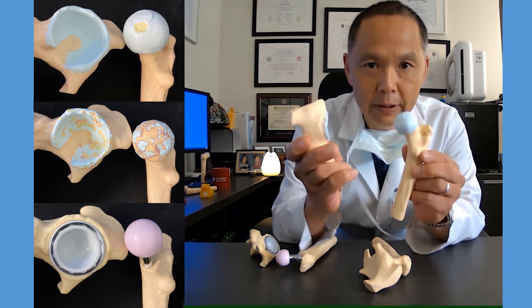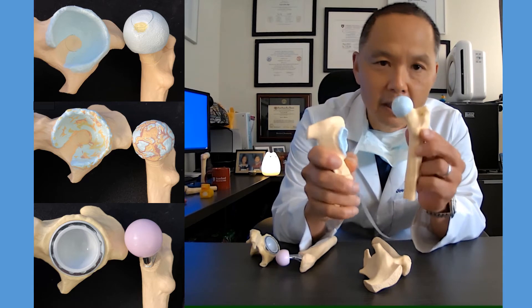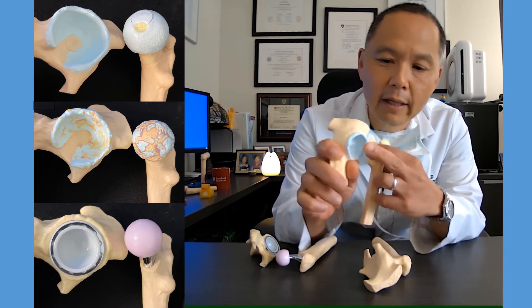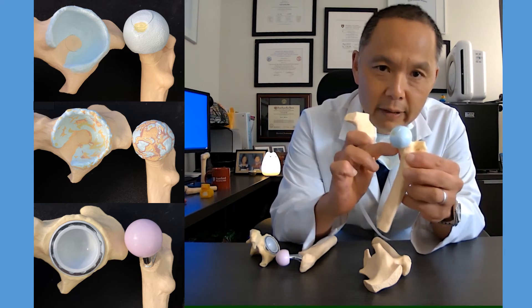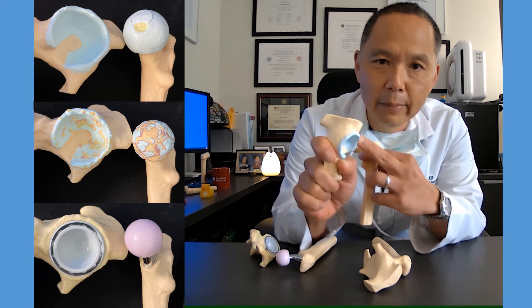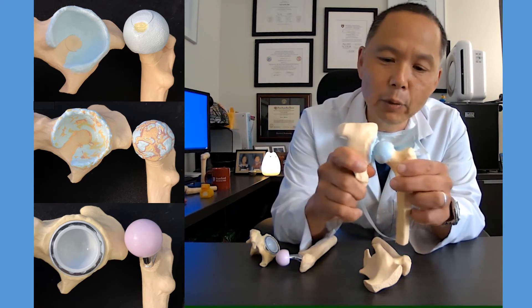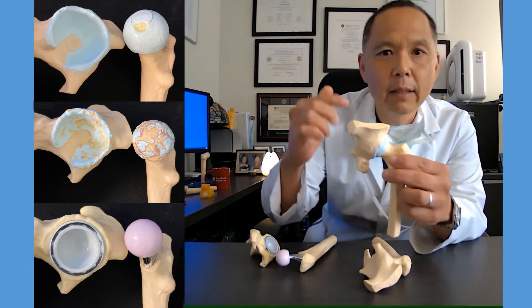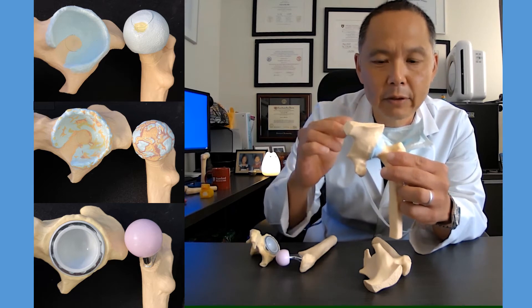When we're talking about a hip, we're specifically speaking about the articulation or the joint between the femoral head and the pelvic socket. So we have the femur with the ball and we have the pelvis with the socket. The hip joint is where these two joints meet. Around the hip, there's bone, muscles, tendons, ligaments, nerves, and vessels.